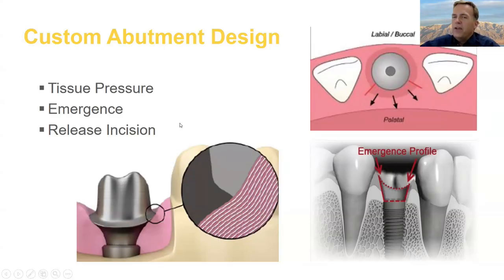So this is a technique you can kind of keep in mind, especially if you're looking at a situation where you're going to have huge dark triangles or something like that. This can be a good fix for it.